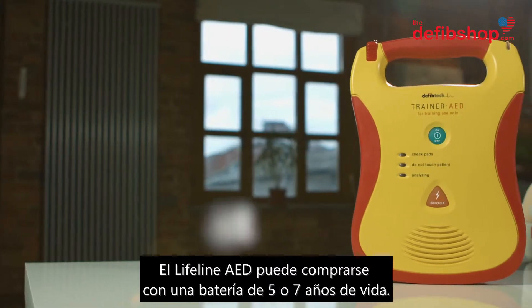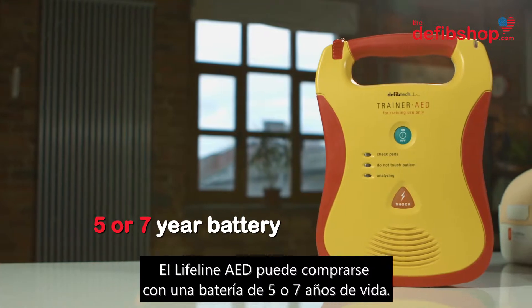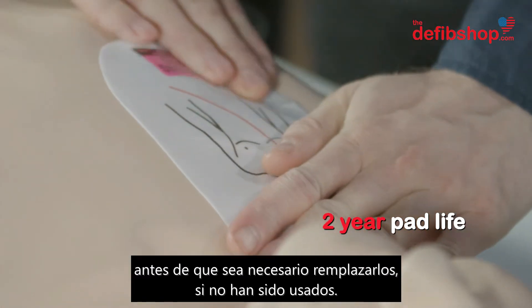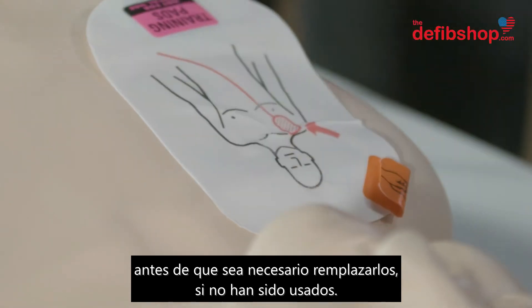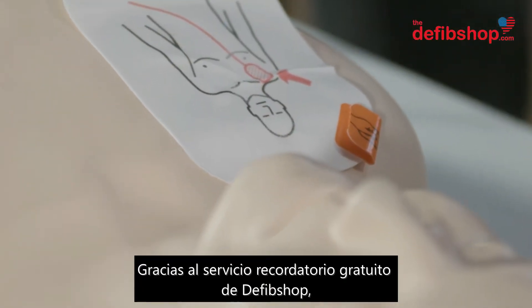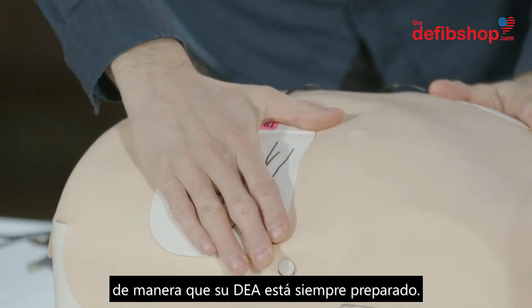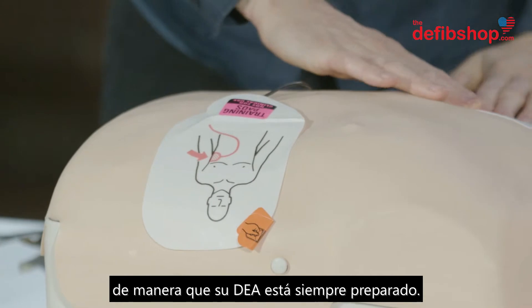The Lifeline AED can be purchased with either a five or seven year battery life. The electrode pads have a lifespan of two years before replacement is required, if they have not been used. Thanks to the free DefibShop reminder service, you'll be notified before your battery and electrode pads expire, so your AED is always in a state of readiness.